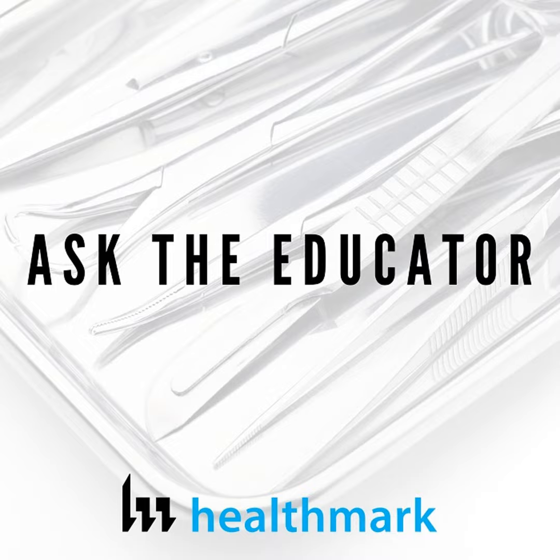And another one that you touched on is understanding what a shaver does. I think that's a great point, because these devices have been around for so long, and even I'm kind of guilty of this, because coming from the OR, that's what immediately comes to mind when I hear shaver, because we're actually not supposed to shave hair in the operating room. So I think of arthroscopic shavers, whereas other people may not. They hook in a disposable piece, and they're either grinding or chopping, and it's bone, it's soft tissue, and a lot of times we see what looks like meniscus or synovium, soft tissue still stuck in that shaver.